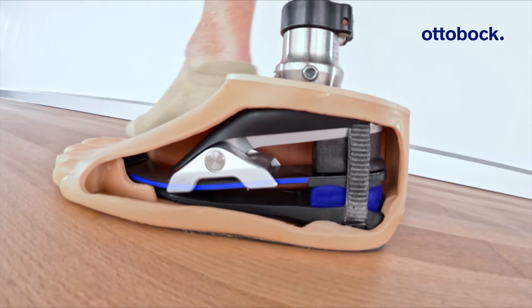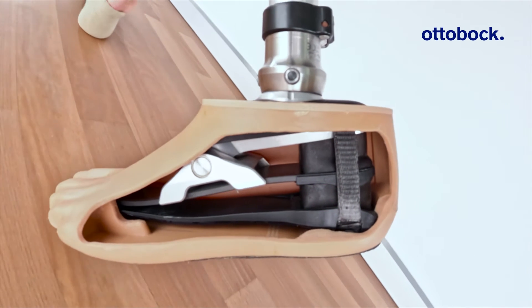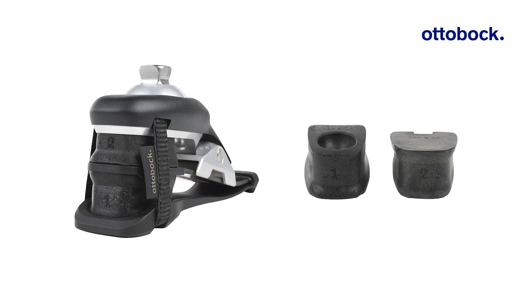The carbon spring and the heel wedges are selected according to each patient's data and are based on extensive user testing. In most cases, the pre-configuration will match very well for the user. However, there might be need for adaptation — therefore the foot comes with two additional wedges to easily adapt the foot to the user's needs.